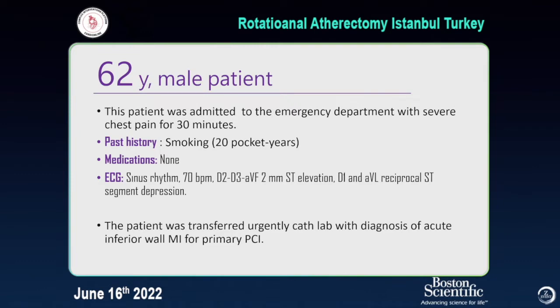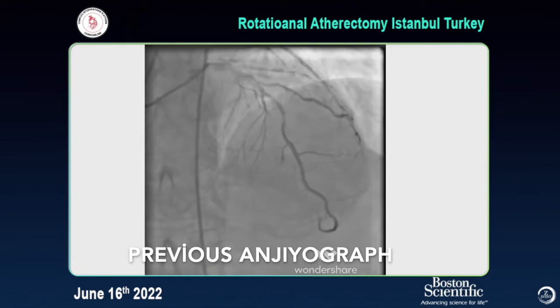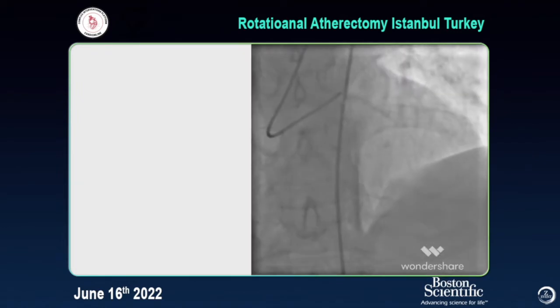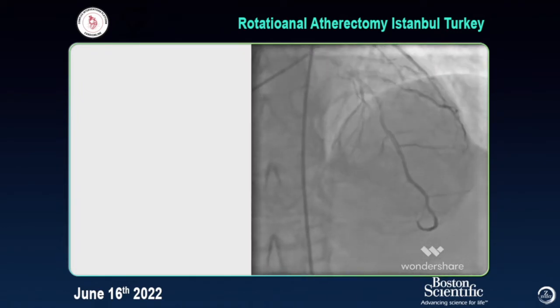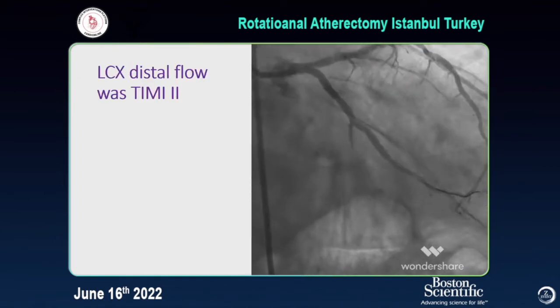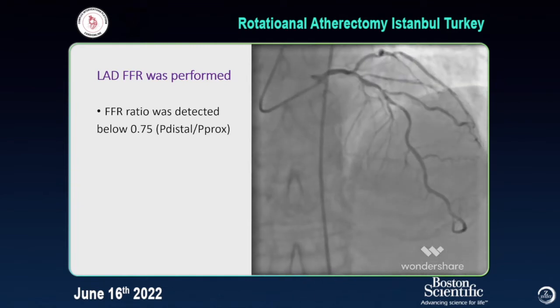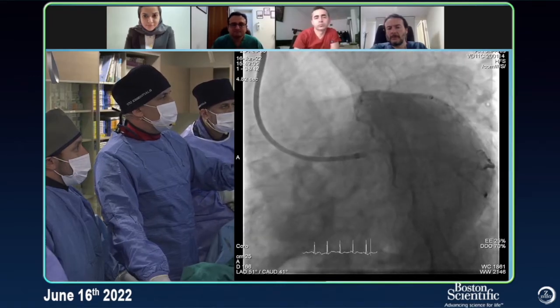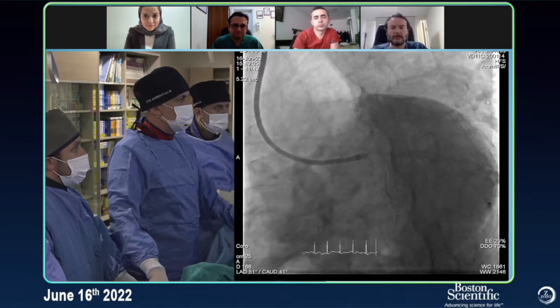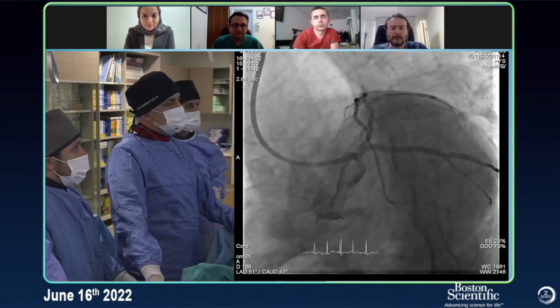We have a 62-year-old gentleman who presented to the emergency department. On angiography, there was a diffuse severe lesion on the LAD involving both the diagonals. You can see a highly calcified coronary on LAD. FFR to LAD was done — as it was looking in some views like a moderate lesion, FFR was done which showed significant result of 0.75. What do you think of the ostium of the LAD? It looks definitely calcified, but there is also a moderate stenosis at the ostium of the LAD.